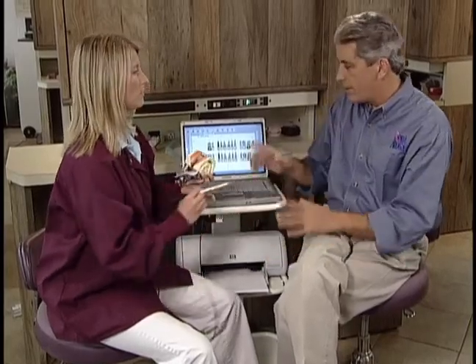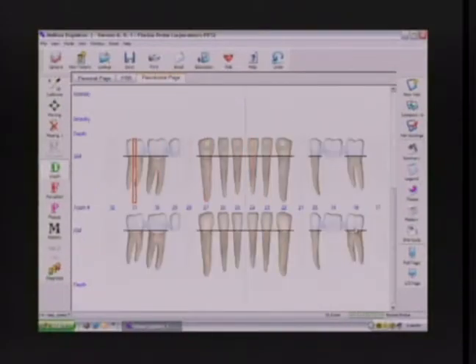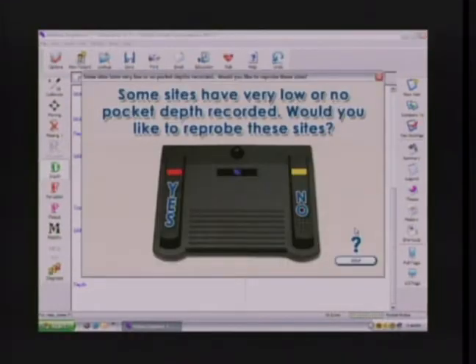I'm going to move us on. Do you have any questions about pocket depth? Feeling pretty comfortable? Yes. Okay, we are at the end of the mode. Stretch, let the patient close their jaw. Everything all right? Let's quick tap advance with the foot pedal. We know that we had some zeros, so we'll say no.